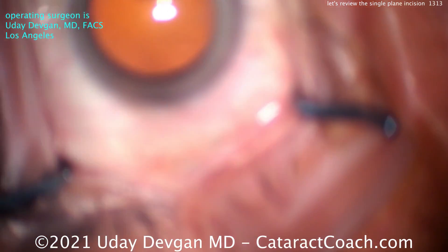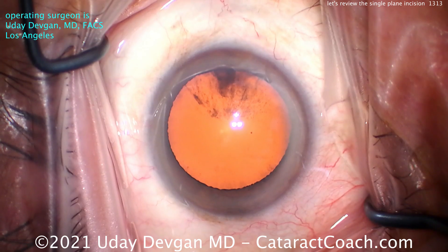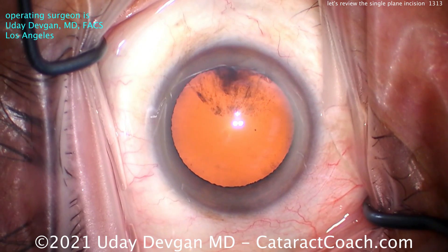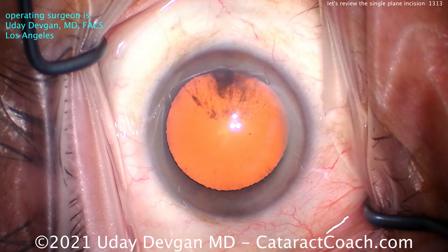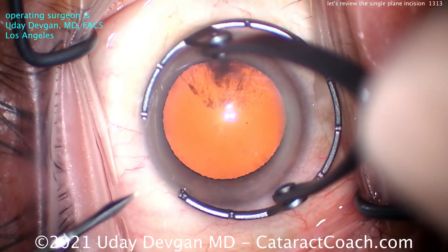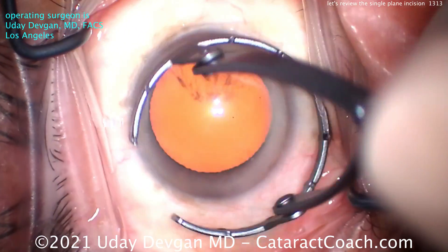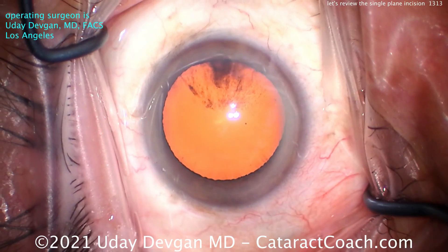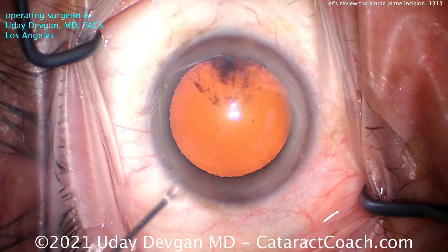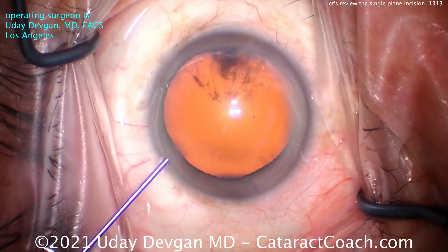So let me talk to you about the main incision. You might ask why I'm showing you the beginning of the case and the paracentesis if I'm talking about the main incision. Here's the reason: when you make this main incision and fill the eye with your anesthetic and then your viscoelastic, the IOP that you give the eye with your viscoelastic determines a lot about the incision.